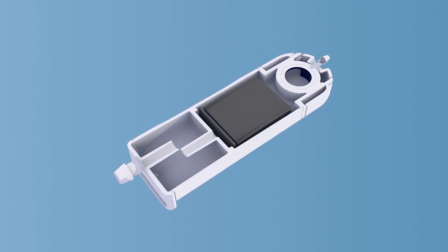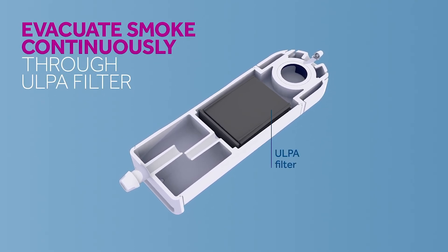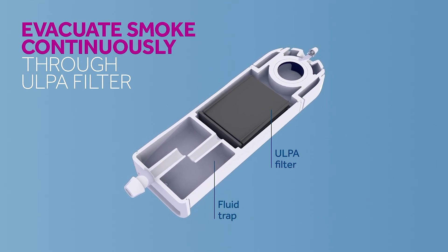Once set, the smoke will be continuously evacuated through a ULPA filter in the device body. Any fluids from condensation will also be collected and will not drip on the floor.